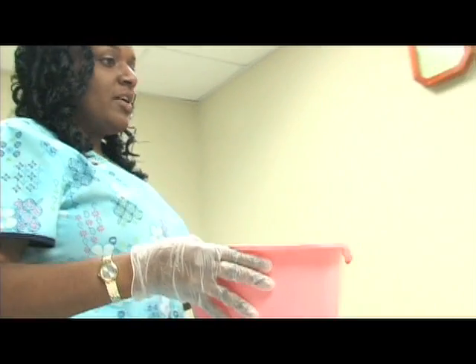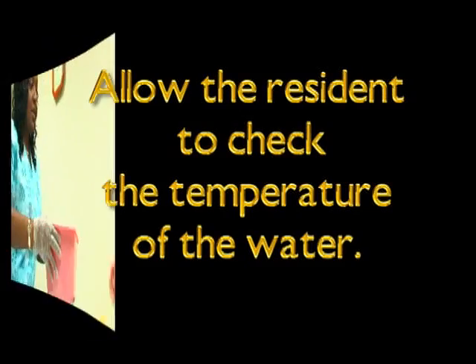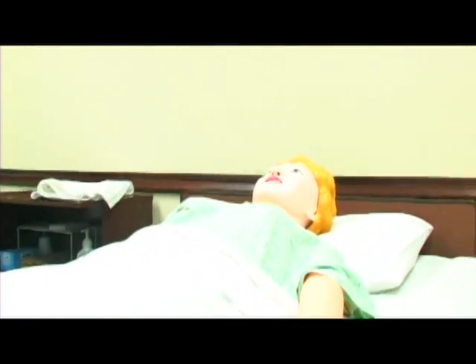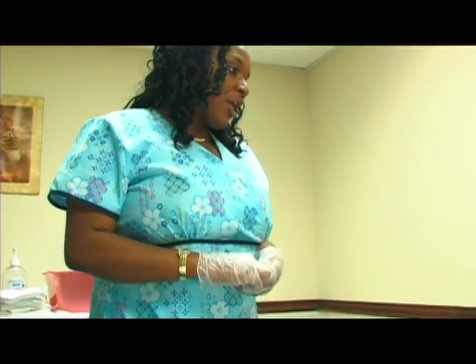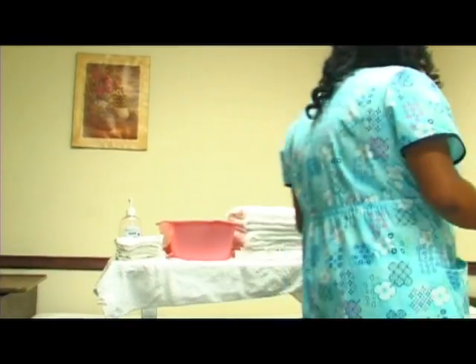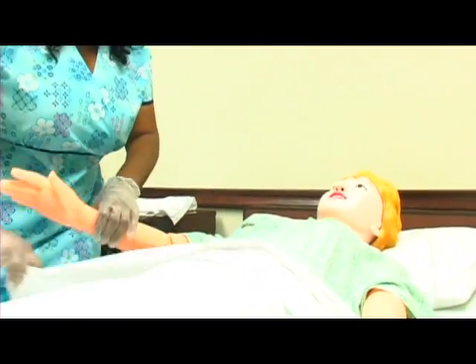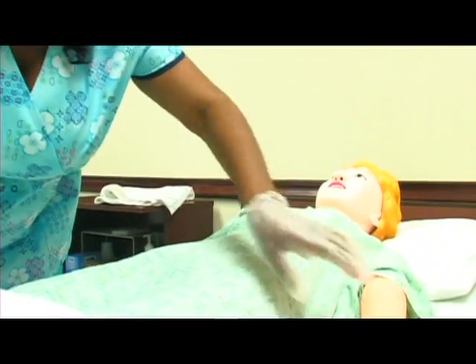I'm here to perform Ms. Jenkins' catheter care. Would you test the water temperature please? Ms. Jenkins, before we begin I'm going to go ahead and pull the curtain. I've already washed my hands and put on my gloves. I'm just going to put a pad under you so that the bed does not get wet while I'm cleaning your catheter.